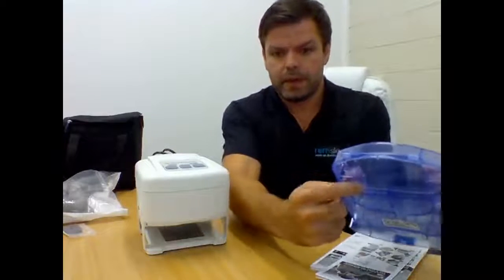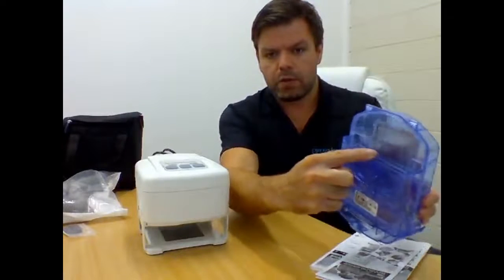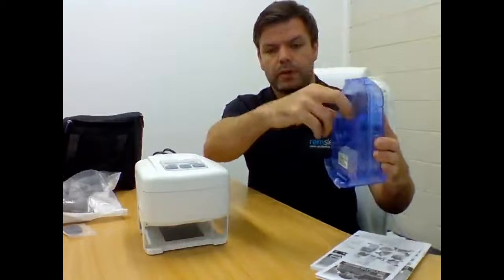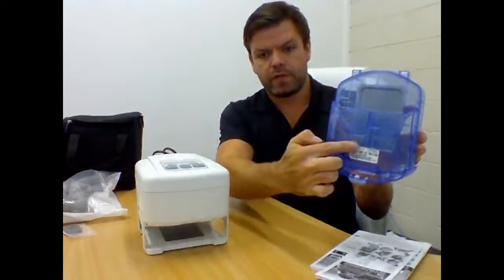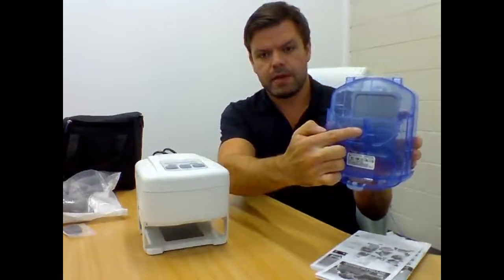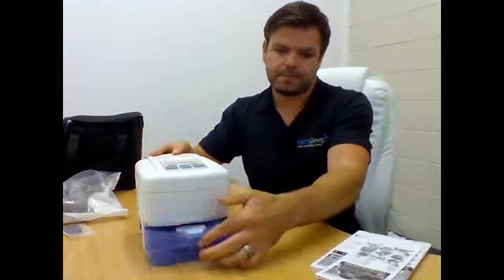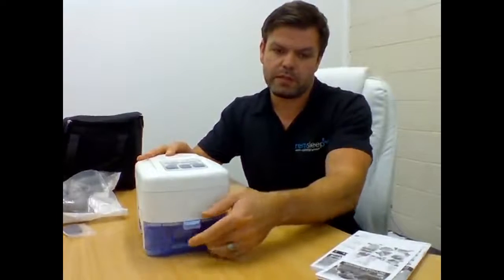At the top here, there are some holes, and all we do is take it over to the sink or get some distilled water and just pour in the top here, and you'll see the water fill up to about here, halfway, and then we just place it back in, like so. Push it all the way until it clicks.